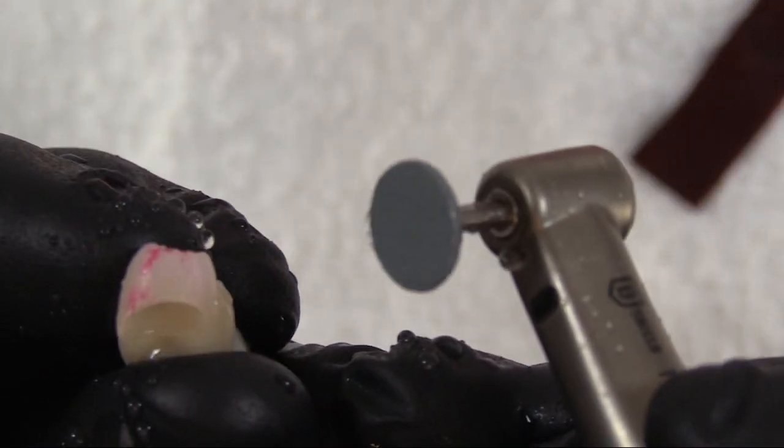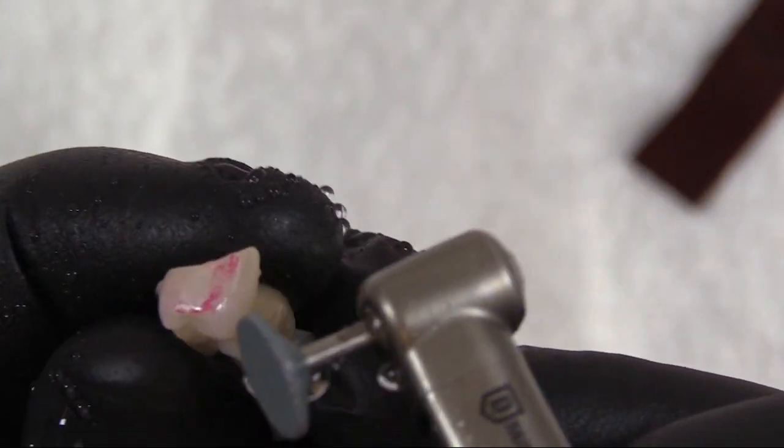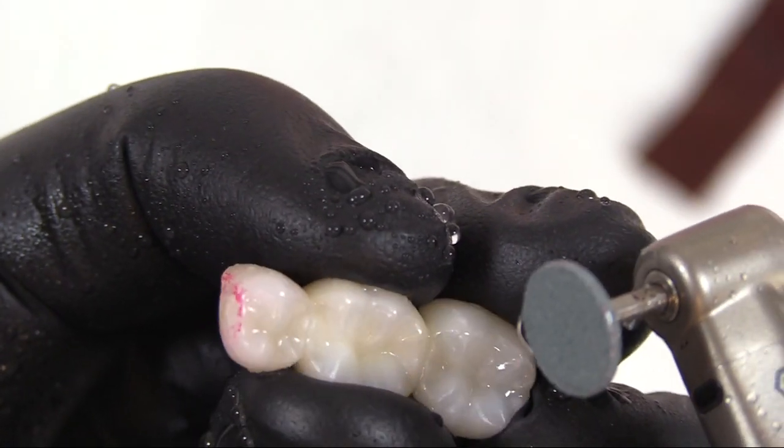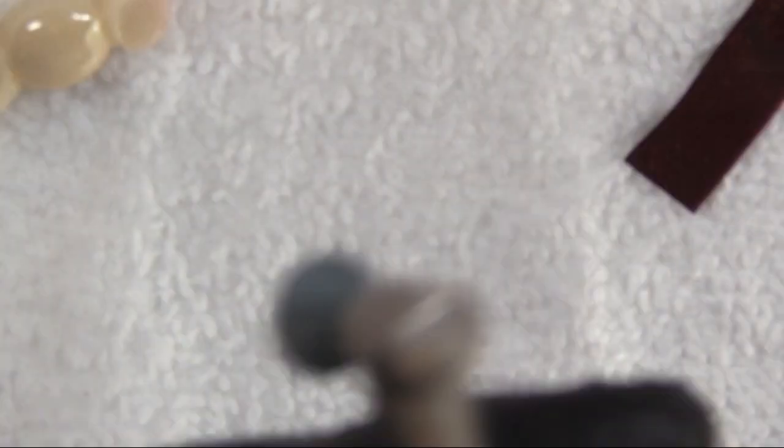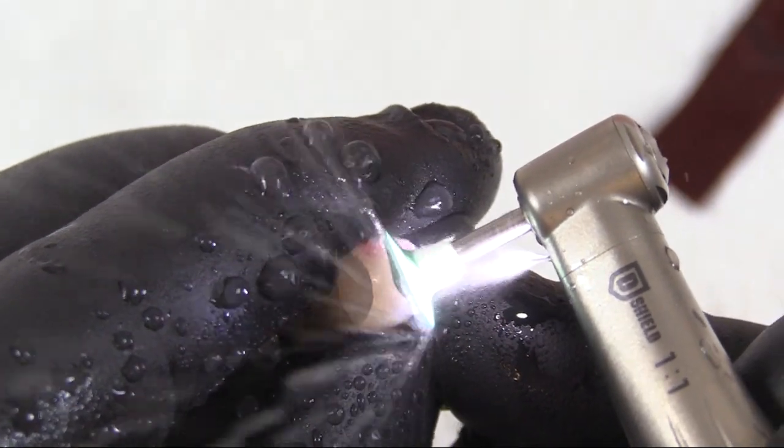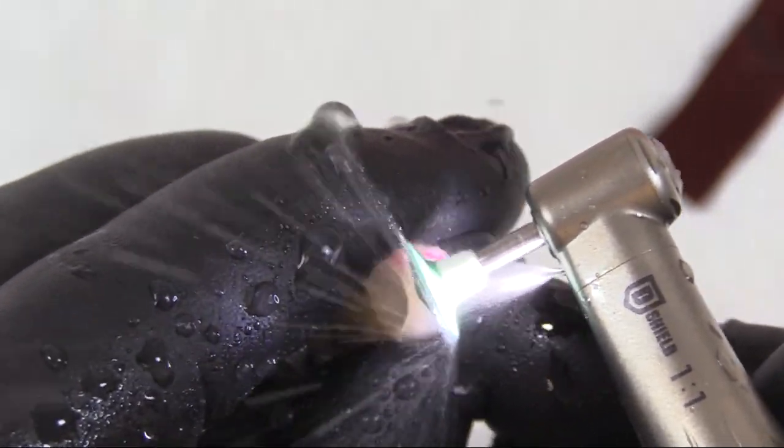Now it's quite rough, and this burr is only used for extensive reduction. Your lab should probably use this, as when you receive it from the lab, it should be pretty much spot on or close to. If you have to use this clinically, you want to follow up with the green medium grit one. Under water, you're going to polish that surface under irrigation and keep it cool.